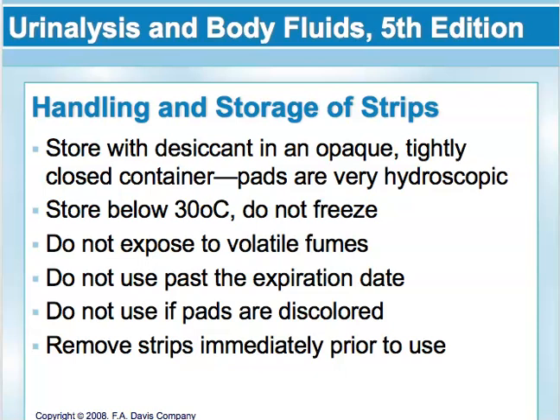Okay, next, and I got a little bit ahead on the slides, handling and storing of the reagent strips. The strips have to be protected from deterioration that could be caused by moisture, volatile chemicals, heat, and light. So you want to remove the strips just prior to testing, and then the bottle should be tightly resealed as soon as you take that strip out.